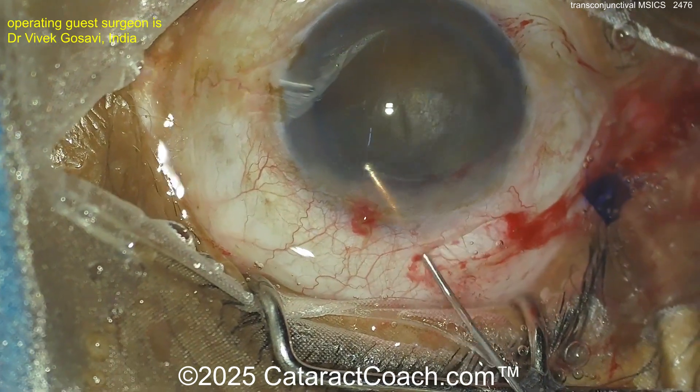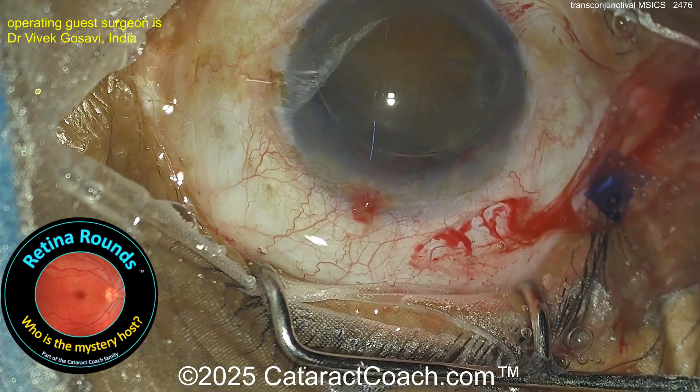Here we go — get that nucleus up, up, up — lift it up there. Fantastic — above the iris, above the capsule.